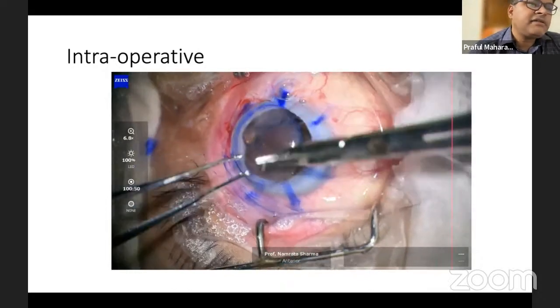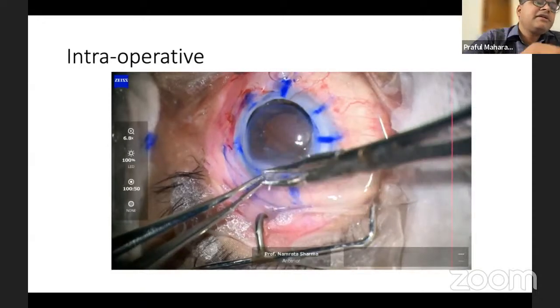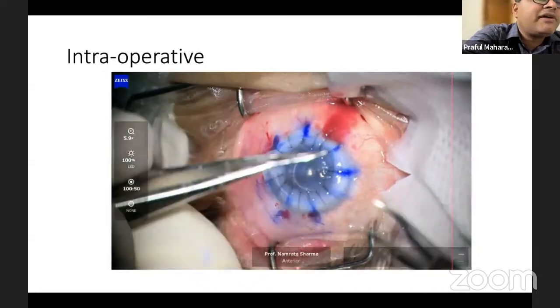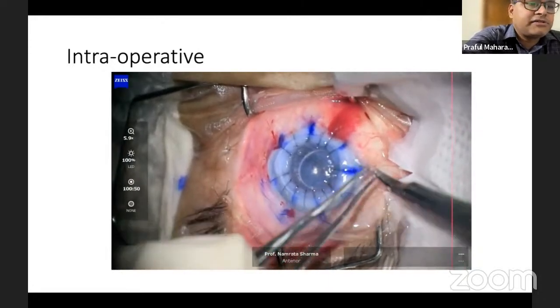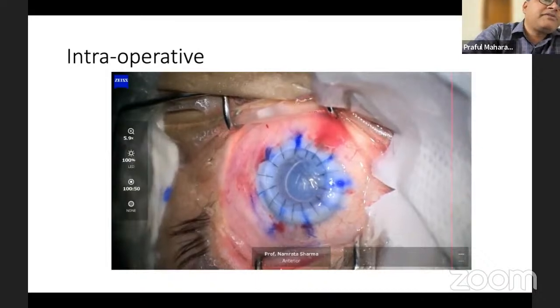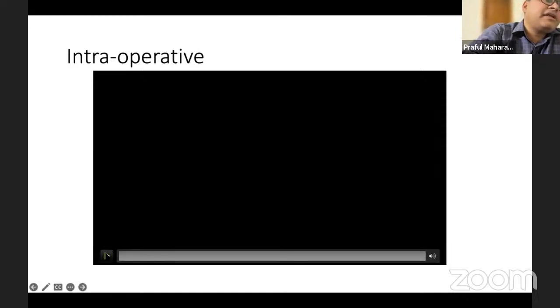Now, once this is done, almost one part is done, cataract and IOL implantation. So 2 out of the 3 procedures have been done, and the rest of the keratoplasty is like simple suturing. But remember, you have to do it a little bit faster. You don't have time. At least put in 6 sutures immediately, and after that you can take your time and do all these maneuvers. Yes, this is a triple procedure with full thickness corneal graft, penetrating keratoplasty, where you are doing an open sky cataract surgery. Now with time, this is the era of endothelial keratoplasty.